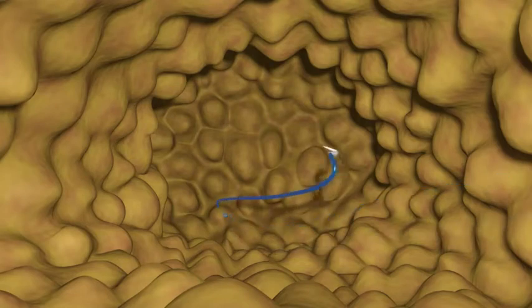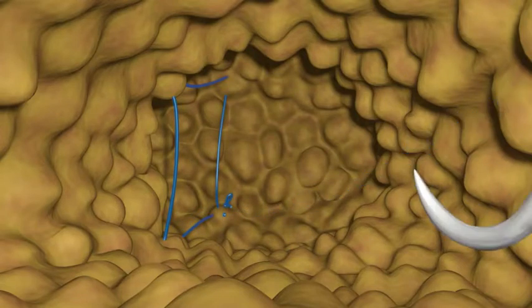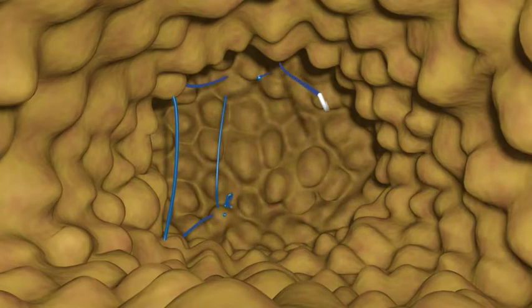However, if you prefer and are planning on advancing tissue, you can place rectangles as shown. First, two box-like rectangles are placed at either end of the lumpectomy. This is quick and easy and works very well for small lumpectomies with limited tissue mobilization.